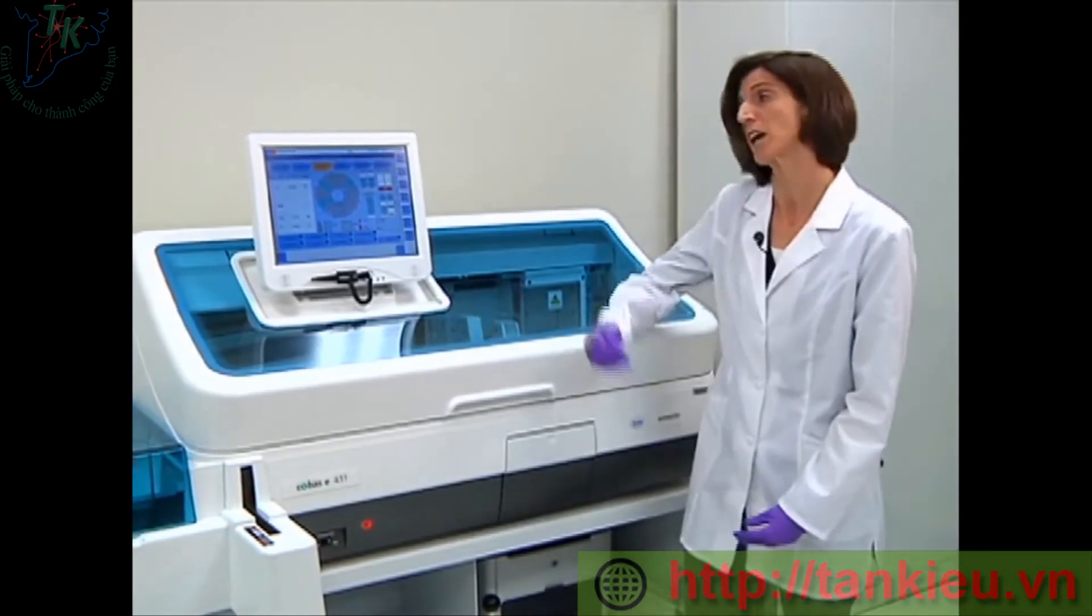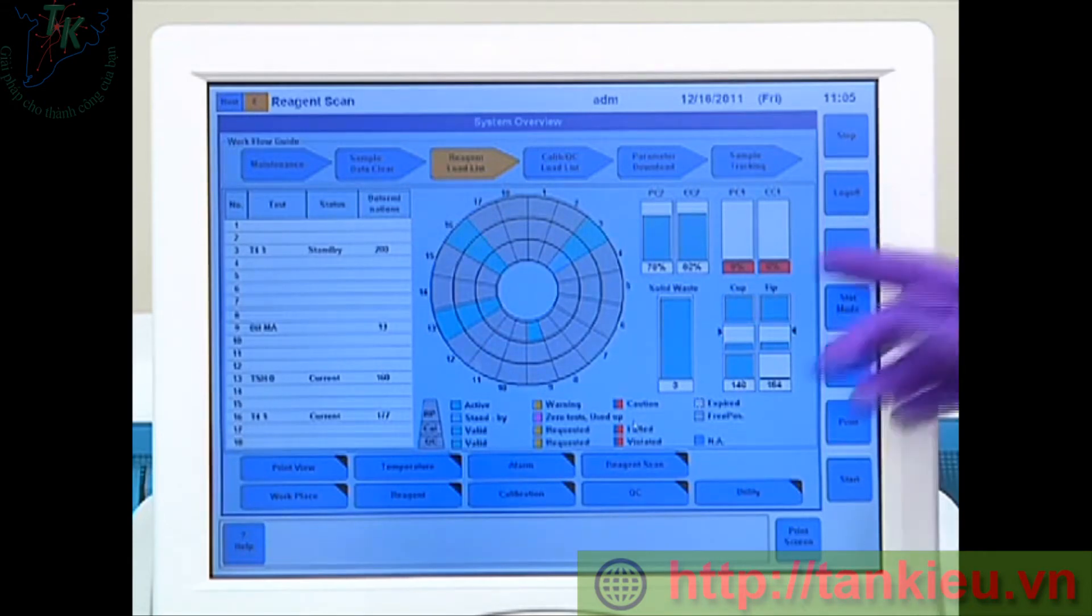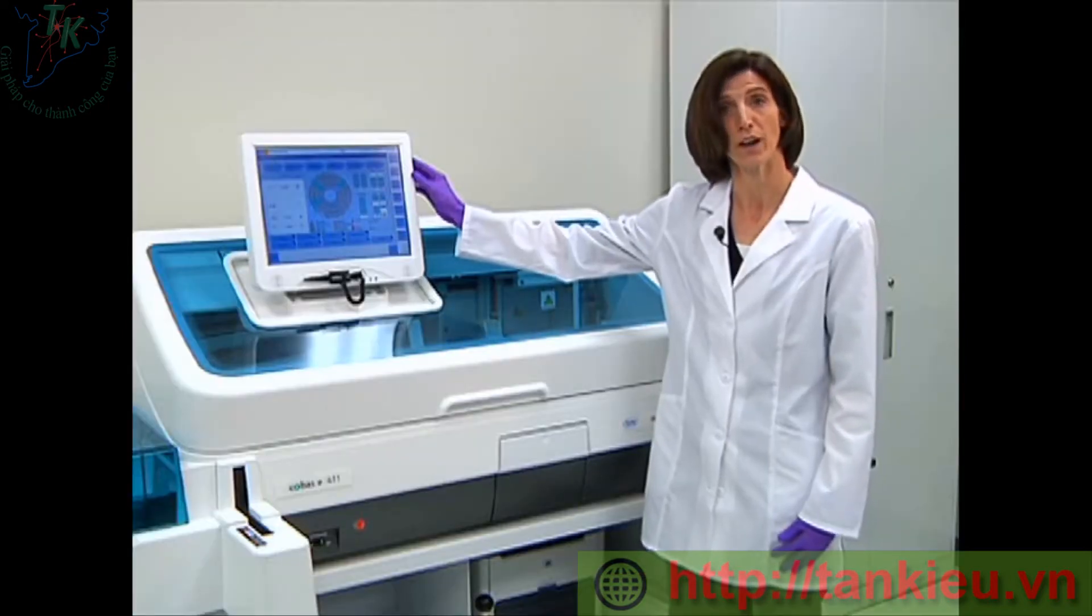In addition, it's going to check both the ProCell and CleanCell inventory and also our cups and tips. Once it finds the ProCell CleanCell set that we loaded, it will update the volume automatically and remove our red color and our yellow color for our reagent load list. After the completion of our reagent scan, we know that we have loaded all of the reagent and consumables required for our daily operation.